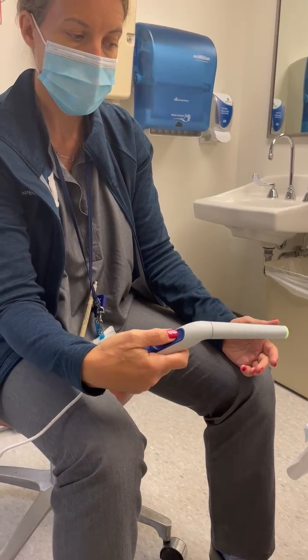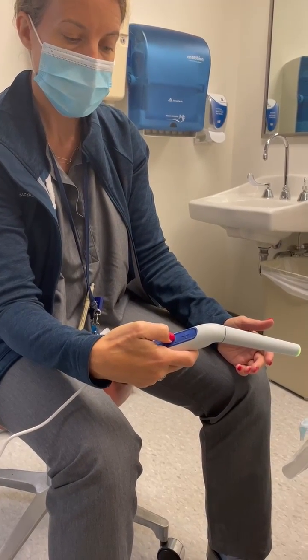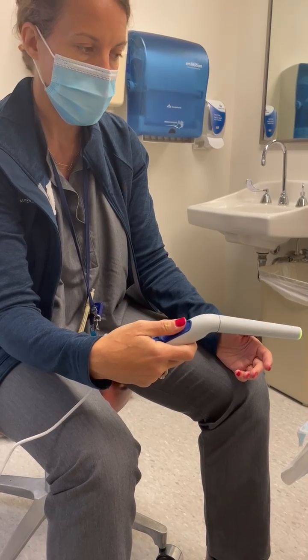These buttons are self-explanatory: this will magnify the image and this will take you back down to a full field of view.